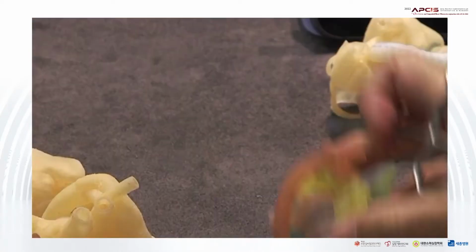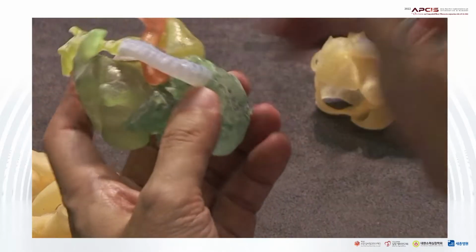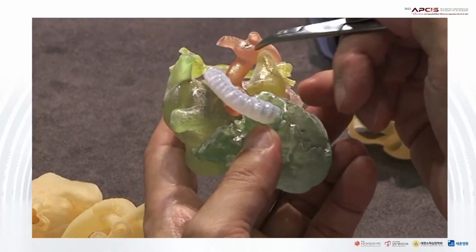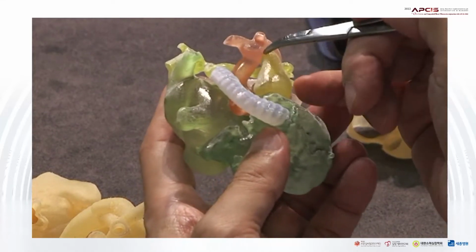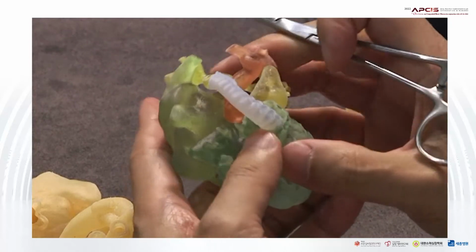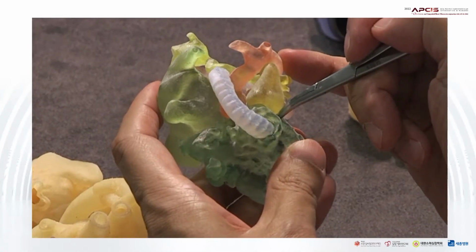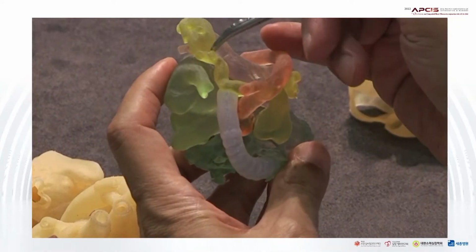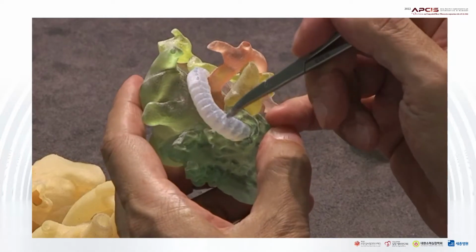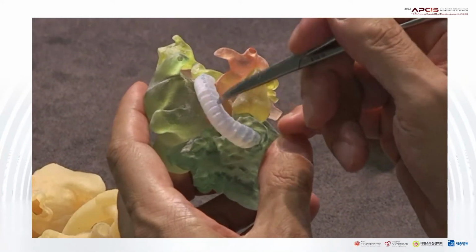Okay. So we did arch repair and connected the pulmonary trunk to the reconstructed aortic arch. So this is a kind of Norwood type operation. And for the pulmonary blood flow, we connected the pulmonary artery with the RV using a 6 millimeter ringed Gore-Tex graft.